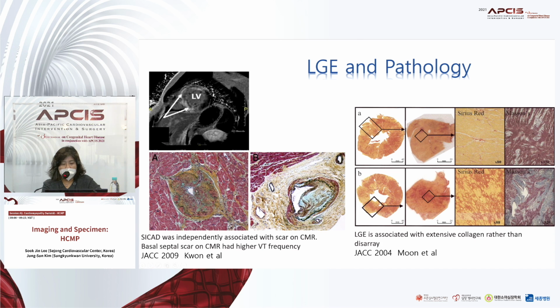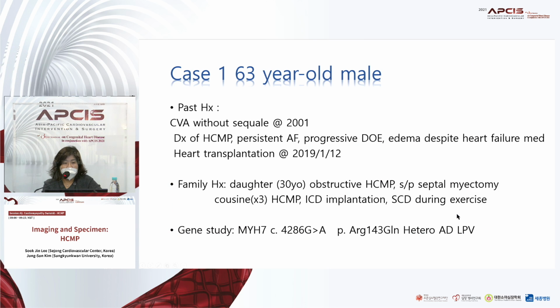And there are several articles showing the correlation of gadolinium enhancement and pathology, and these authors showed that this MRI LGE was associated with intramural coronary artery dysplasia, and these authors showed that this scar in pathology was correlated with collagen accumulation.